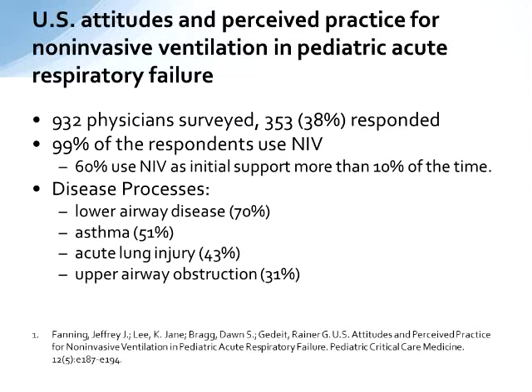These researchers, Fanning et al., conducted a survey of just north of 900 pediatric physicians, with 38% of those folks responding, and they were asked, do you use non-invasive ventilation in your pediatric population? 99% of those respondents actually said that they did, so overwhelmingly, non-invasive ventilation is being used in PICUs around the country. 60% of those respondents actually reported using non-invasive ventilation as their initial form of support at least 10% of the time. So using non-invasive ventilation as a means to potentially avoid endotracheal intubation.